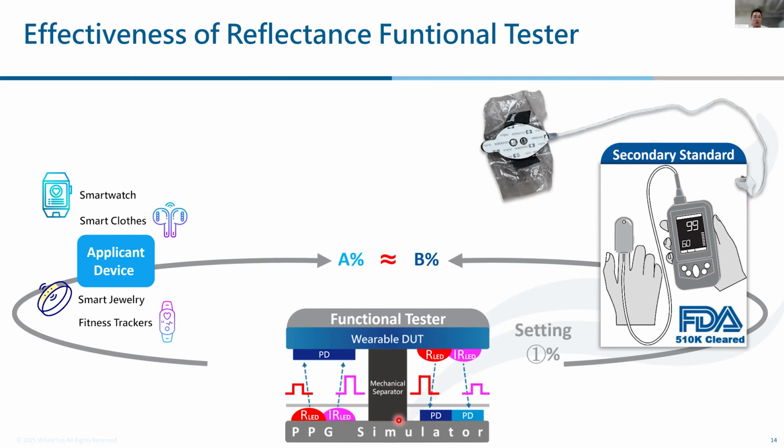Then I will just use setting 1, get reading 1, setting 2, reading 2, setting 3, reading 3. And if I can manipulate the reading of the 510K devices, then this should be working properly for these kinds of secondary calibrations.